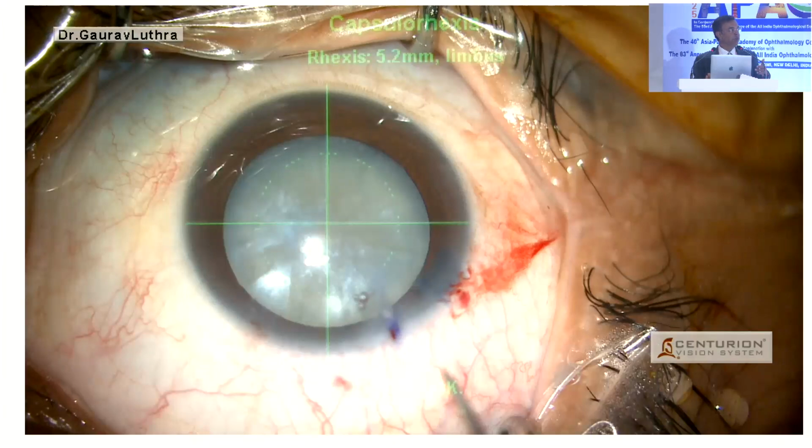So in 6 months or a year, if this patient ever has a problem, usually they don't, but if in a few years they start with a dead bag or whatever, and start having a small tilt, I just put one suture around the CTR because it's fibrosed by that time. And wherever it is, I just anchor it to the sclera at that point. There have been only very few that I have had to. But sometimes I go in with a CTS and do a bipolar 2-point fixation.